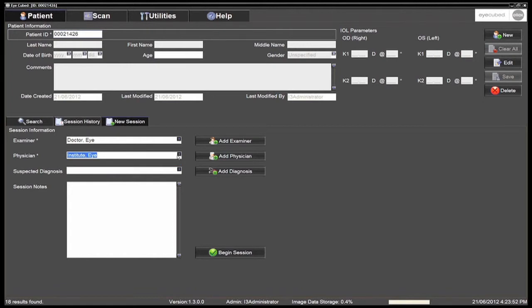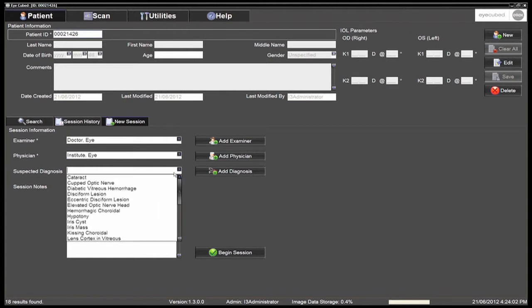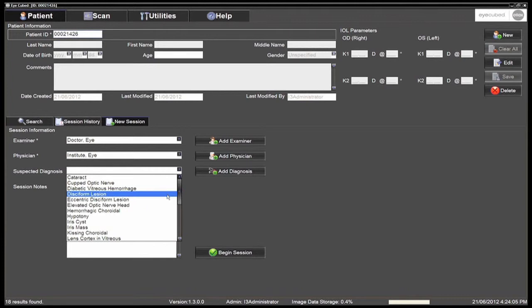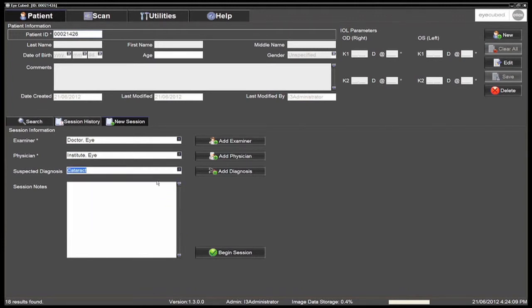A default examiner and physician may also be selected. At this point, it is possible to add a suspected diagnosis that will be saved in the patient's file. Click begin session to start the examination.